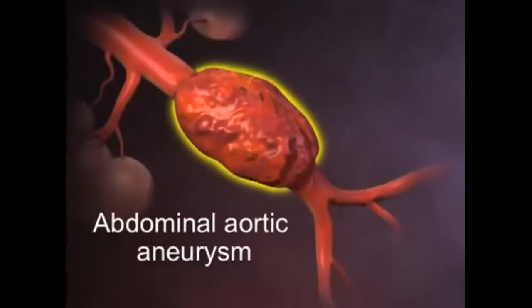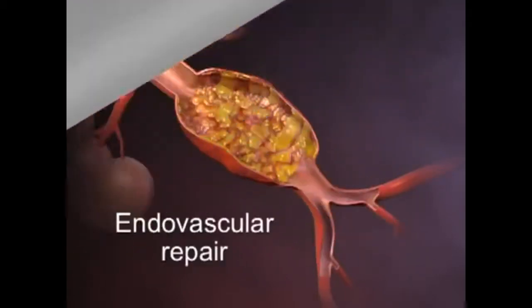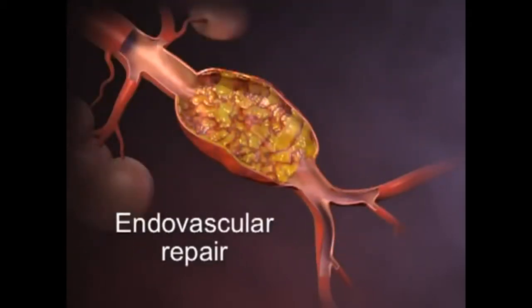The traditional approach to abdominal aortic aneurysm repair has been an open surgical procedure. Endovascular repair using an endovascular stent graft is a more recently developed approach.